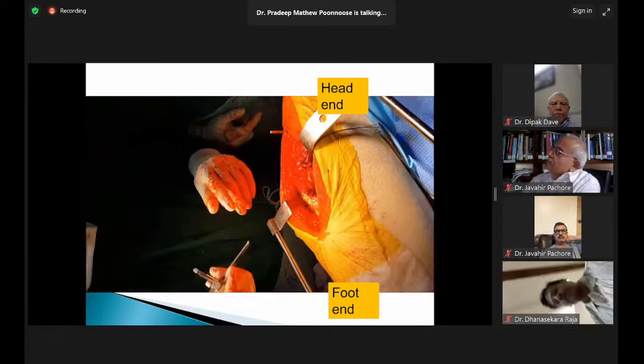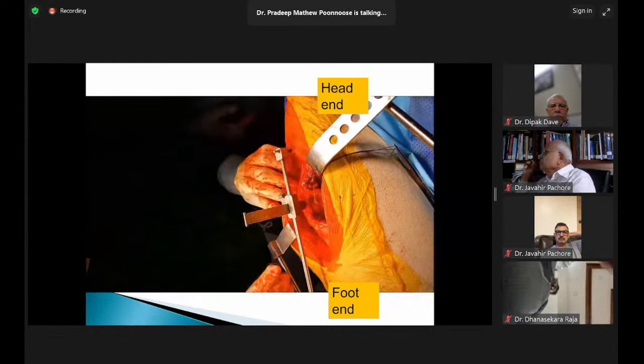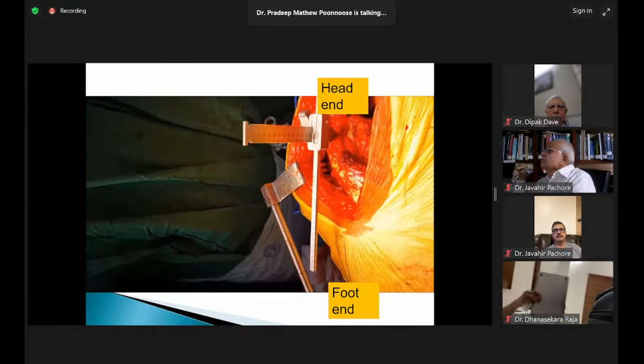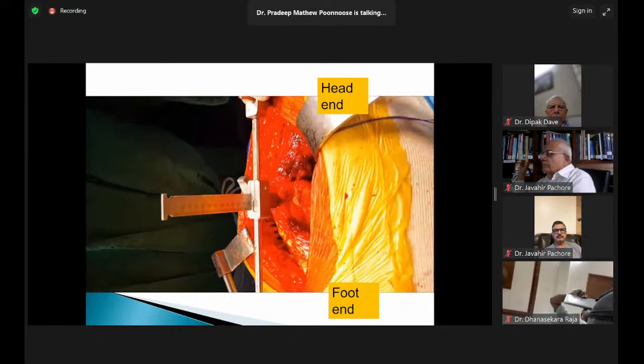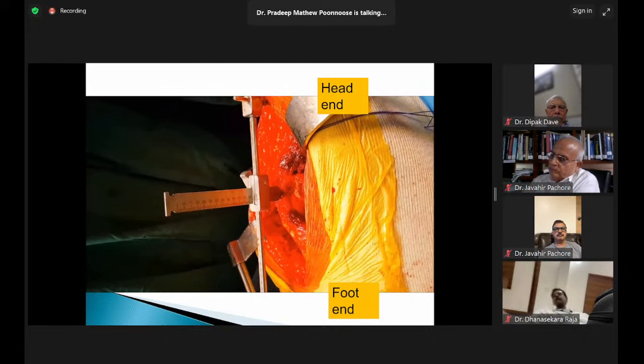You put the head back, you're taking the same caliper and you're putting it on the post, and you can see that point is pointing exactly again at that same point on the trochanter which you've marked, which means that you reproduce the soft tissue tension like it was before. You reproduce the horizontal offset and you reproduce the length.